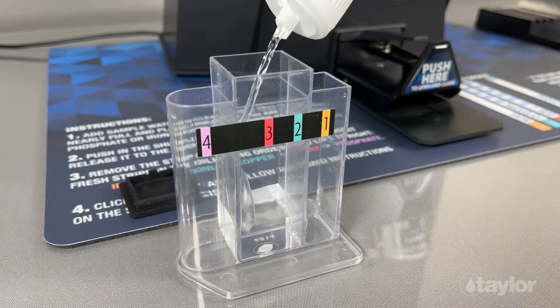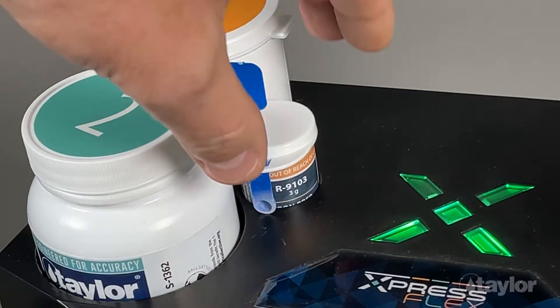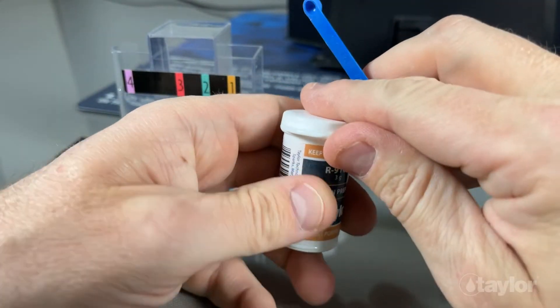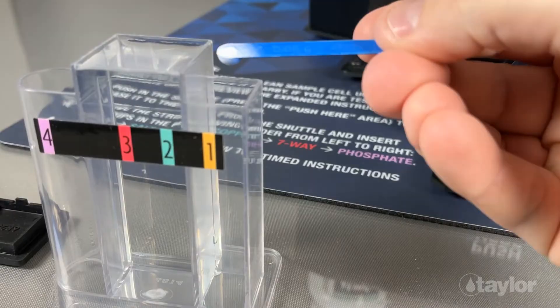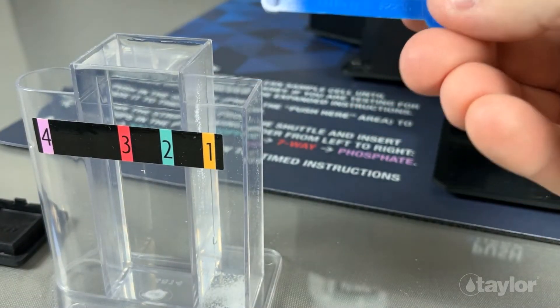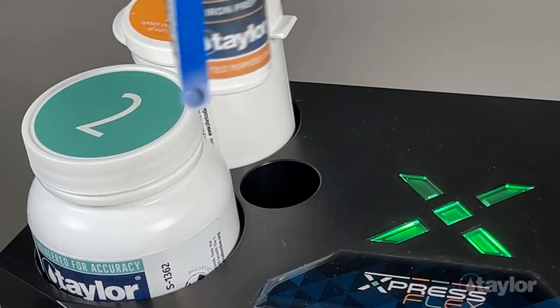Fill the main chamber of the test vial first. Prep reagents are used with both the iron and phosphate test strips, and they ensure the highest level of accuracy for these tests. Pro tip: add the prep reagents to the empty chambers so that the addition of the water helps mix the sample.